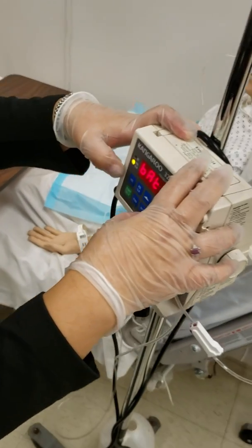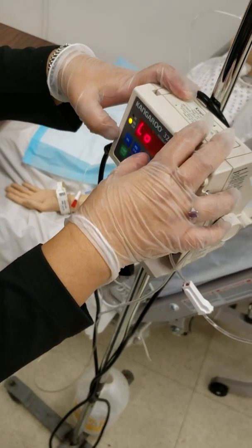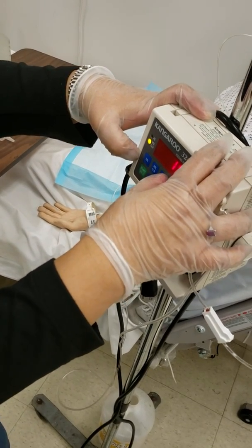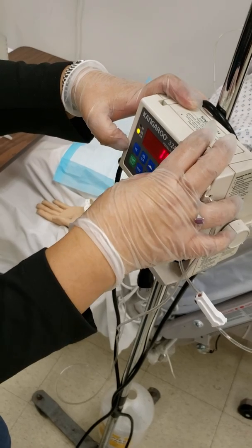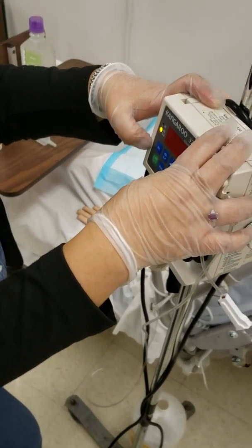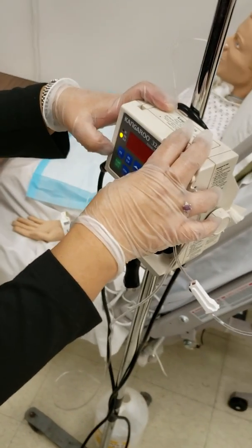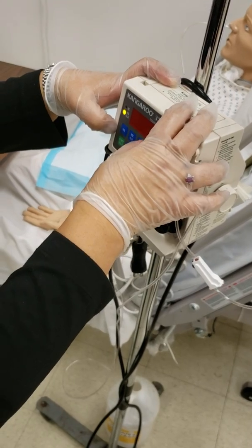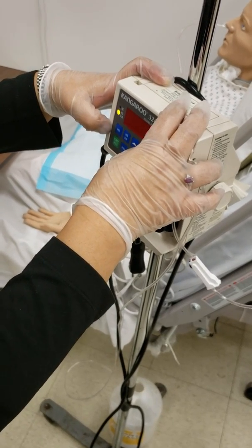Volume to be infused. So you just press how much, you know. I hope it's not moving. I guess 10 is the maximum. Yeah, I guess so. And then oh, it is. Yeah, so I think it's between only 1 and 10.